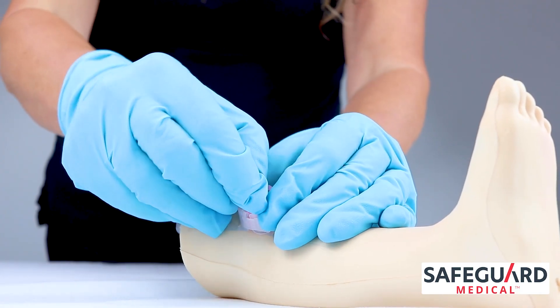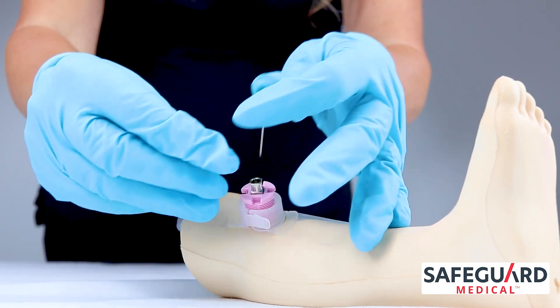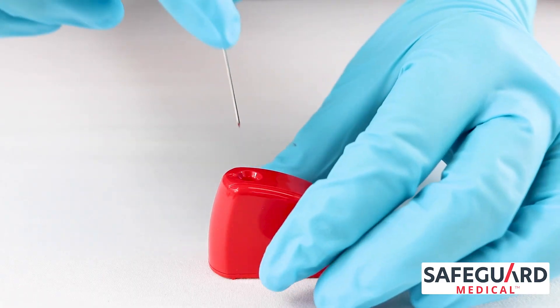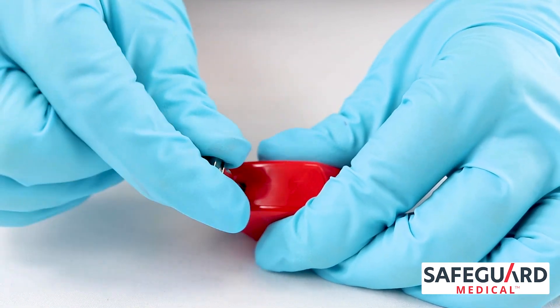With your non-dominant hand, hold the stabilizer base. Use your fingers to remove the trocar from the cannula — a twisting motion may be necessary. Once removed, place the trocar in the needle vice sharps block found in the GO-IO kit.